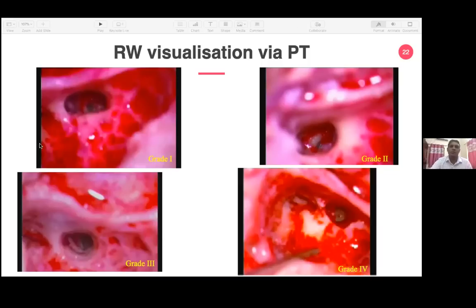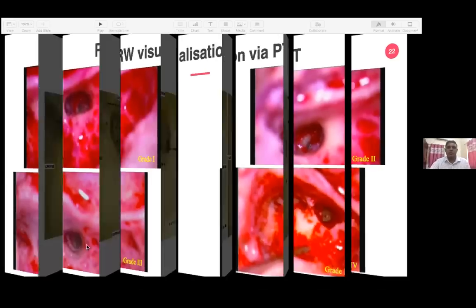Thomas Hospital from London. The grade 3 situation is where the round window membrane is not that great, that is less than 25%. Here we are not at all seeing any round window membrane. So this is a grade 4 situation. In this sort of situation, one has to resort to a bony cochleostomy in most cases. Here, one can try an extended round window, or one can go ahead with Brackmann's technique and do a cochlear implantation electrode via either extended round window technique or a round window technique.